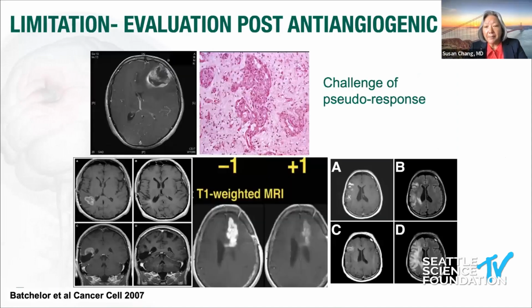And probably what really led us to being challenged is the impact of anti-angiogenic drugs such as bevacizumab, where we see this dramatic decrease in contrast enhancement 24 hours after administration, which is really not compatible with what we consider a cytotoxic effect. This is just a reconstitution of the blood-brain barrier. The other challenge is seeing worsening FLAIR despite improvement of contrast enhancement. So what are we really seeing when we look at these scans after these types of treatments?